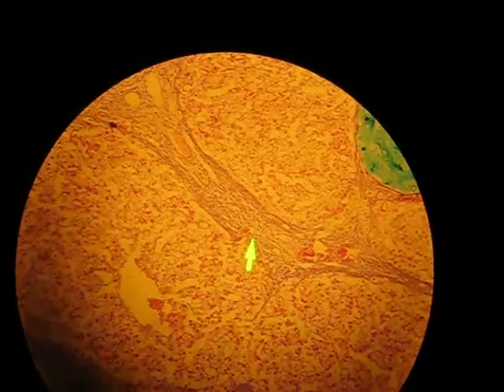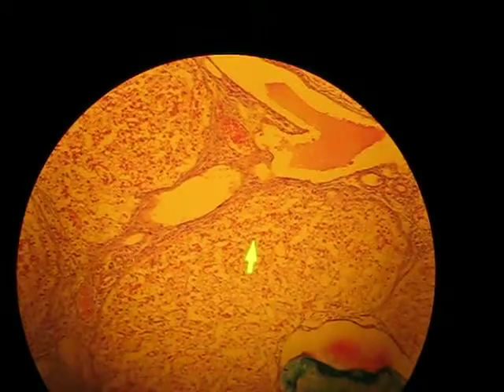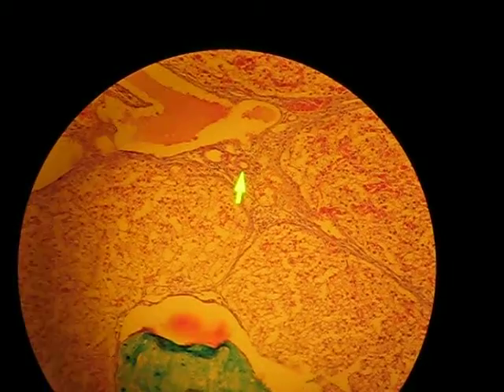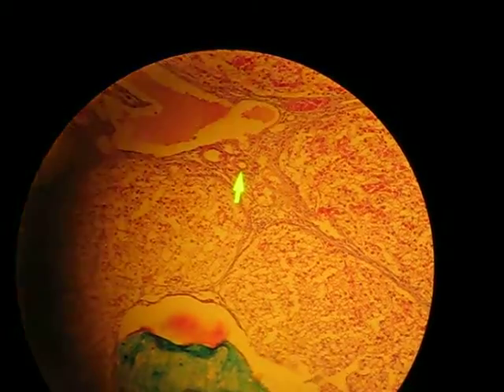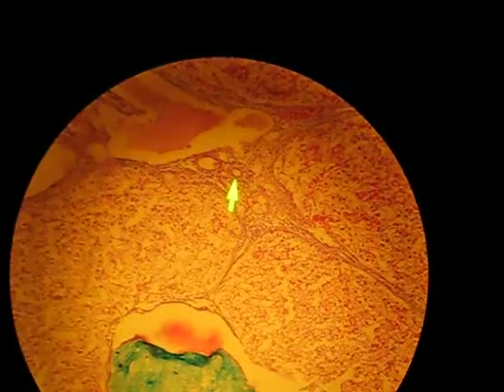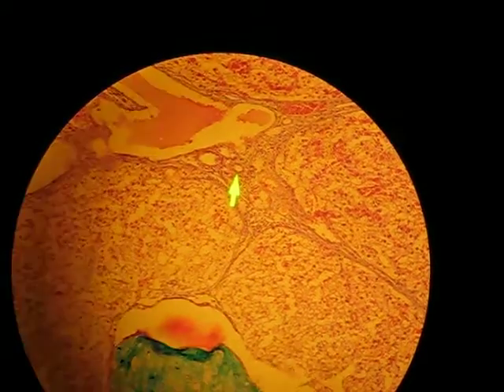All right, here we go. I'm in the next periportal area over. Oh my gosh. Oh, I found a different periportal area. Obvious duct. Okay, arrow's just under it. Cuboidal epithelium. Oh yeah. Okay. That's really nice. So it'll be really round. The nuclei are all lined up with all that cuboidal epithelium. So that's a bile duct. Okay, very cool. They'll look like that.